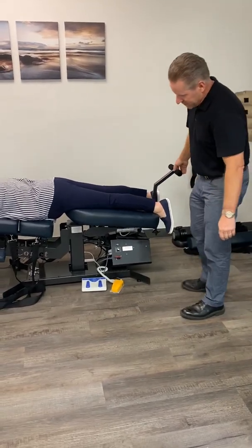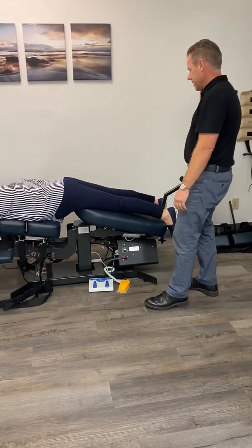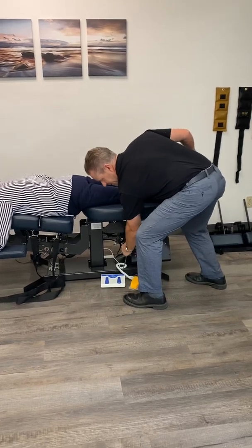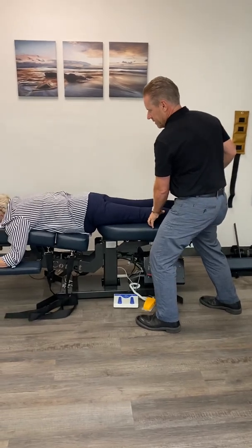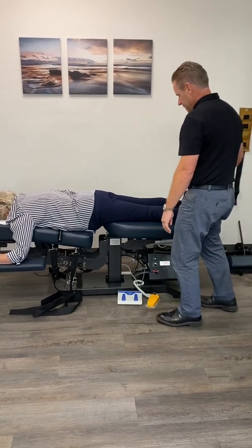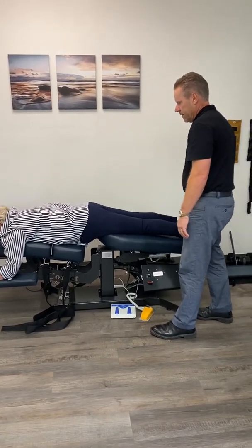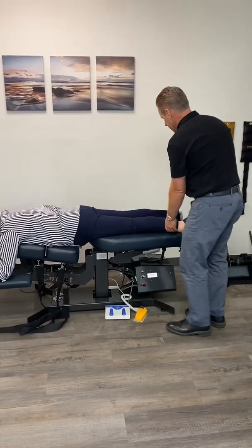We're going to put this in here, and we're going to institute a little bit of lateral motion. In fact, I'll wait until we're up to the top here. Sorry for interrupting, Mom. But now we're going to release this lock. And now you notice we can go that way, we can go this way. So let's go ahead and add some lateral treatment. So we're going to get this going so that now, can you feel that a little bit more on the left side? Yes.